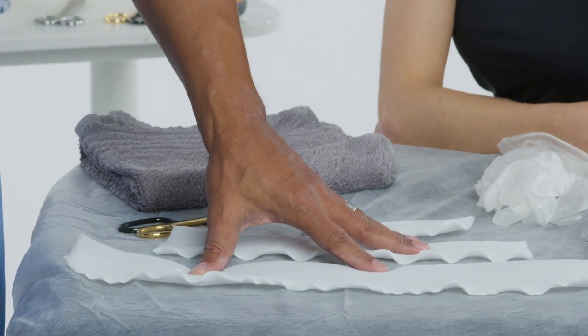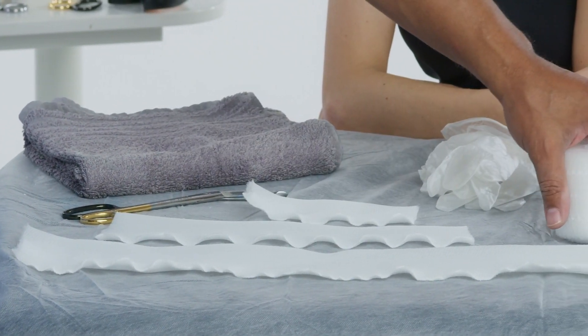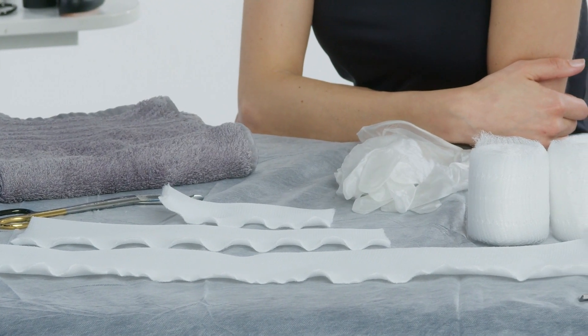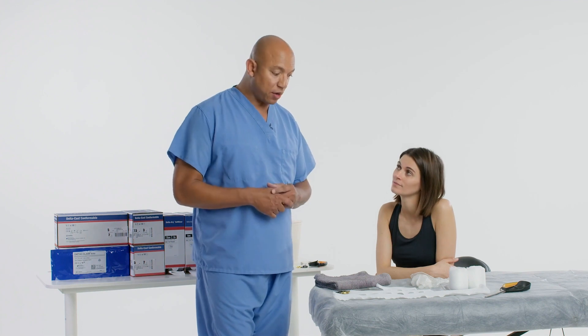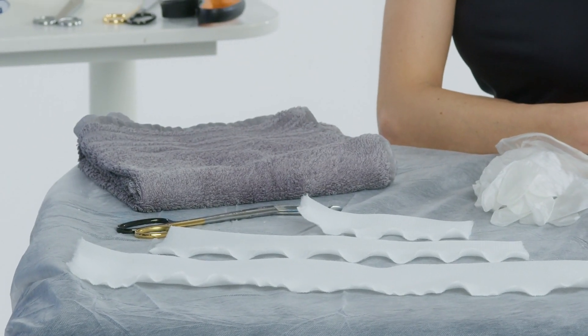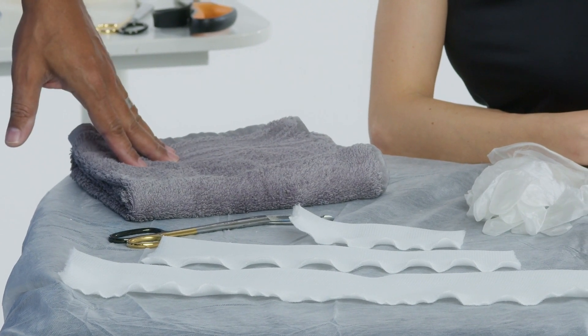I have my cut stockinettes here and then I have the padding itself. We're going to apply the padding like you would cut cast tape, and I'll be using DeltaCast conformable cast tape, which is a polyester cast tape that's going to be really nice and conformable to the patient's hand. I'll also be using a splint inside of the cast to make it a little bit easier to get on the patient.